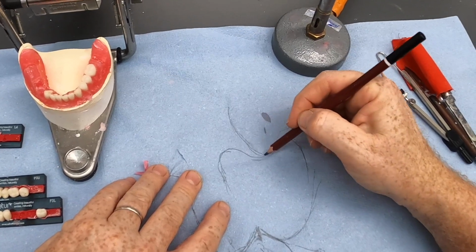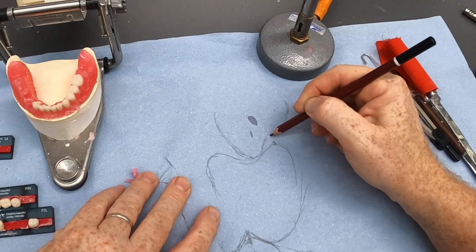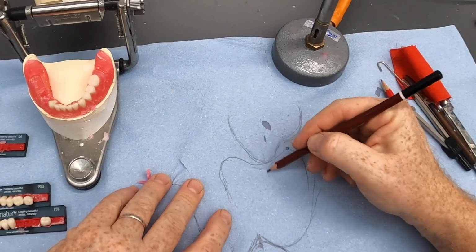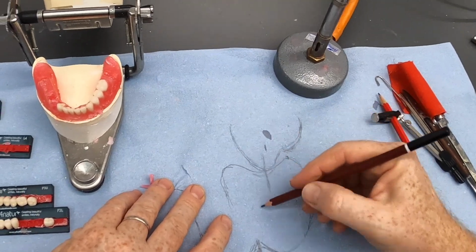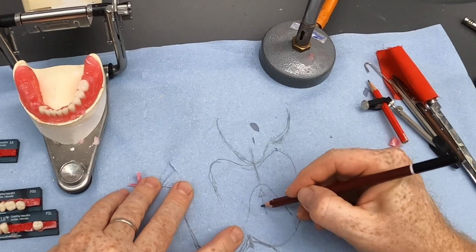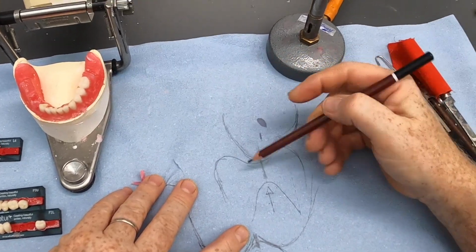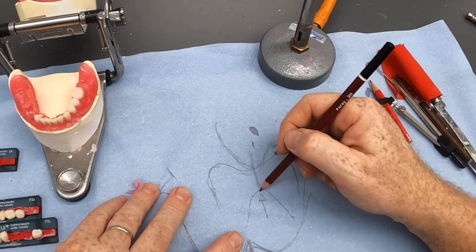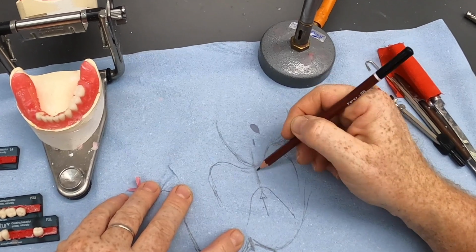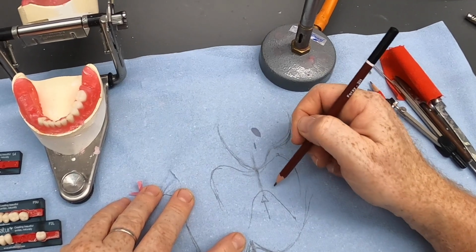I'm exaggerating a little bit here, but you get the idea that we're only trying to achieve a single contact between the upper and the lower tooth, which makes everything a lot easier to engineer, and we want that single contact directly above the alveolar ridge. So hence why we try and put the central fossa of the lower tooth above the ridge, and we get the palatal cusp contacting in that central fossa directly above the ridge, and hopefully we've got a nice stable denture.